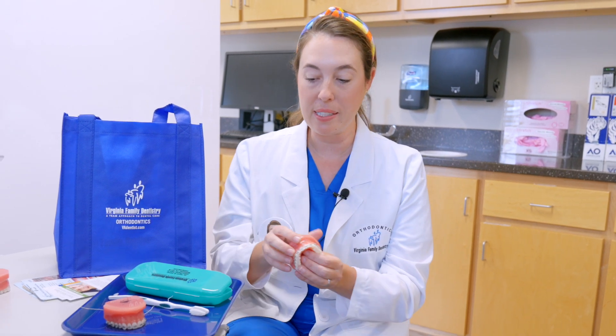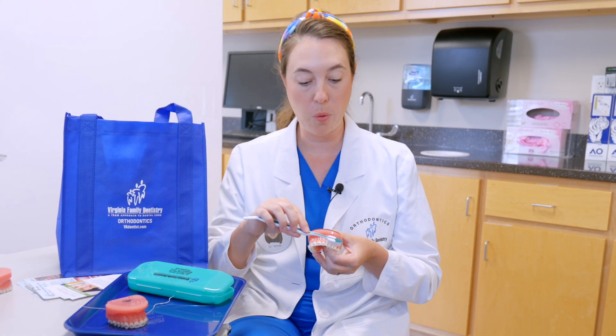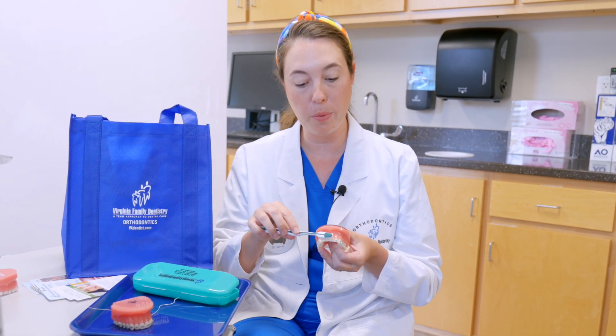We give you, the day the braces go on, all the things that you need to help set you up for success. One of the big things with brushing with braces is you have to spend that extra time getting all around the braces. So you want to do these small circular motions in all the different angles.